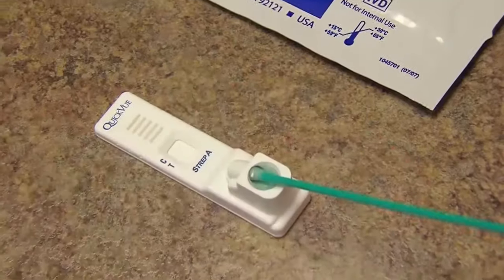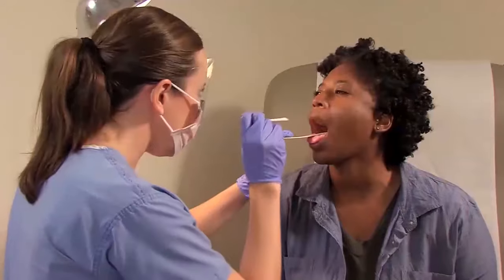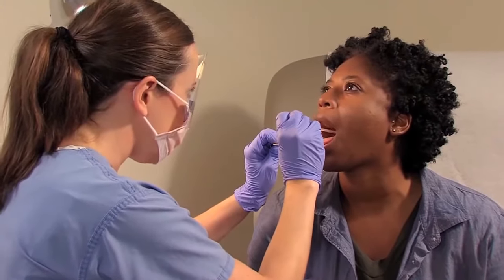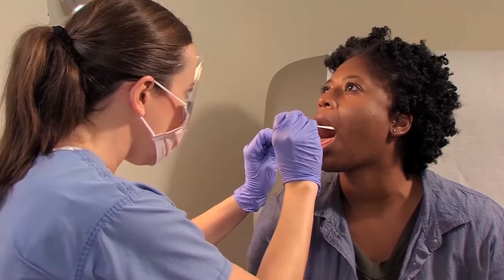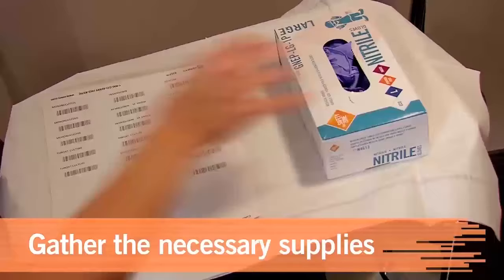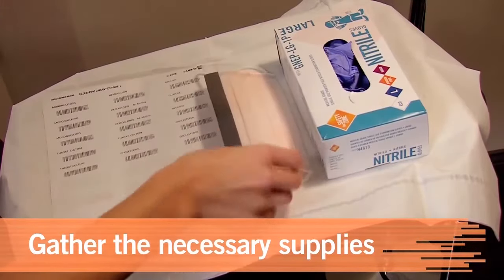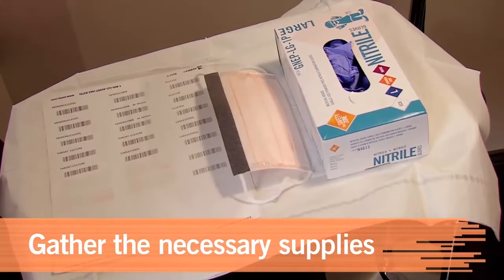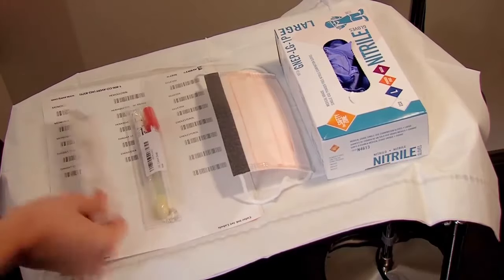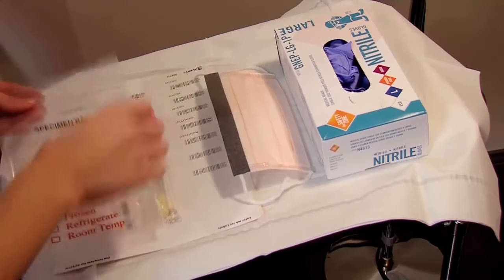To help diagnose strep throat infections, throat specimens are often collected in the provider's office. Begin by collecting your materials: non-sterile gloves, face protection, a sterile swab and tongue depressor, and a transport medium.